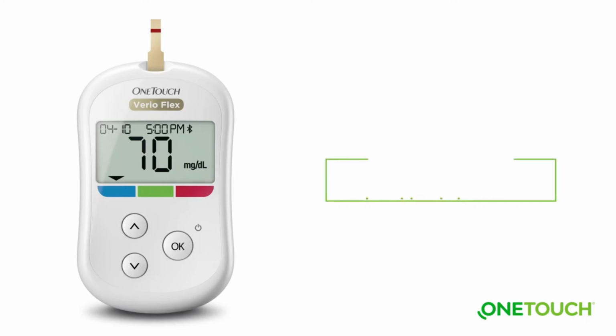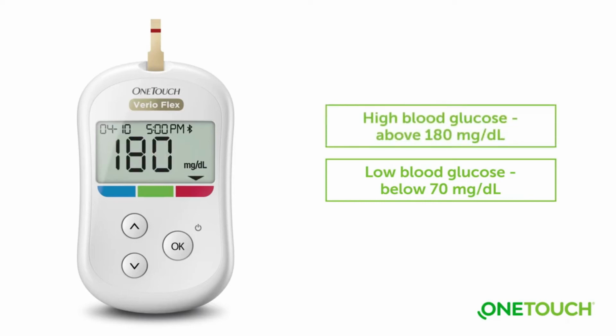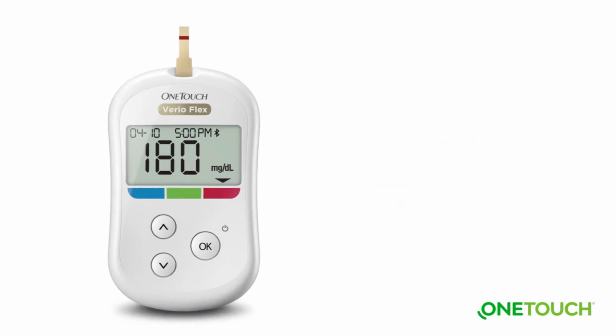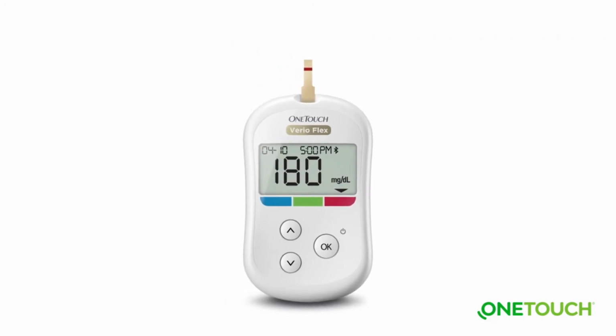The preset low range limit is 70 milligrams per deciliter, and the preset high range limit is 180 milligrams per deciliter. Be sure to talk to your healthcare professional about the low and high range limits that are right for you. When selecting or changing your limits, you should consider factors such as your lifestyle and diabetes therapy. Never make significant changes to your diabetes care plan without consulting your healthcare professional.